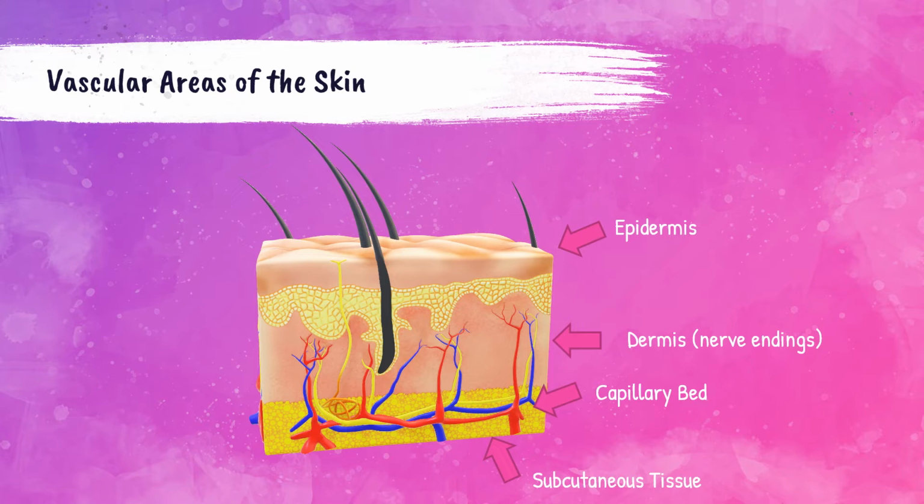The amount of blood that flows from a puncture is based on how many capillaries are severed with the width of the puncture device, so not how deep it goes, but what the width is. This photo shows the vascular area of the skin. The epidermis is the outermost layer of the skin. The dermis is the inner layer of the two main layers in the skin. It contains tissue, blood vessels, sweat glands, nerves, and hair follicles.